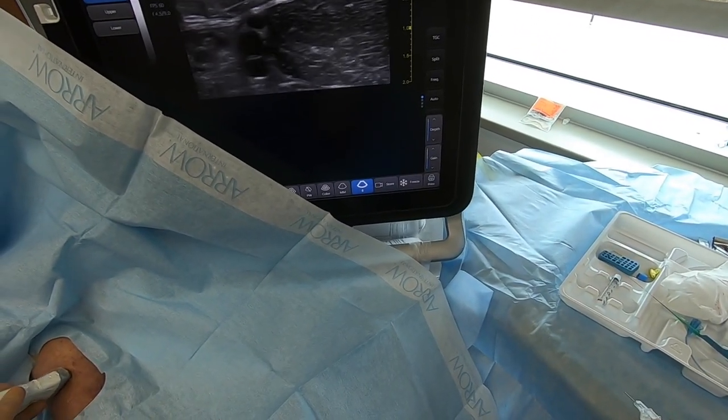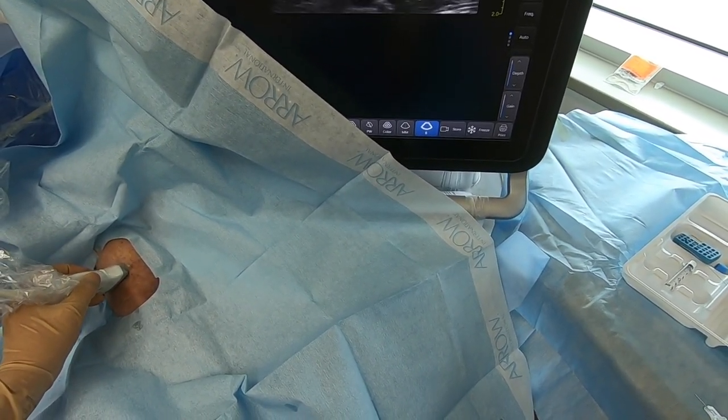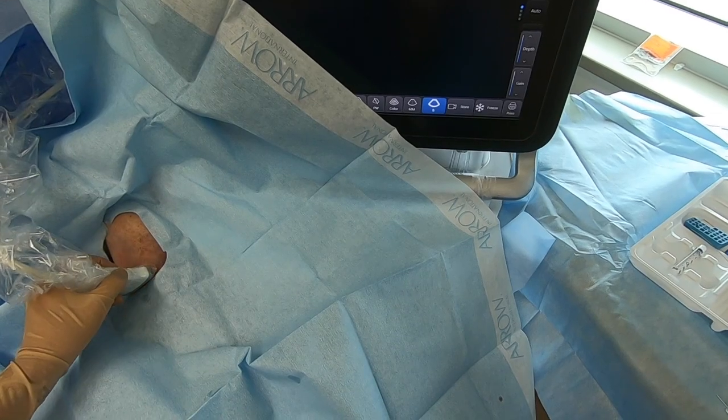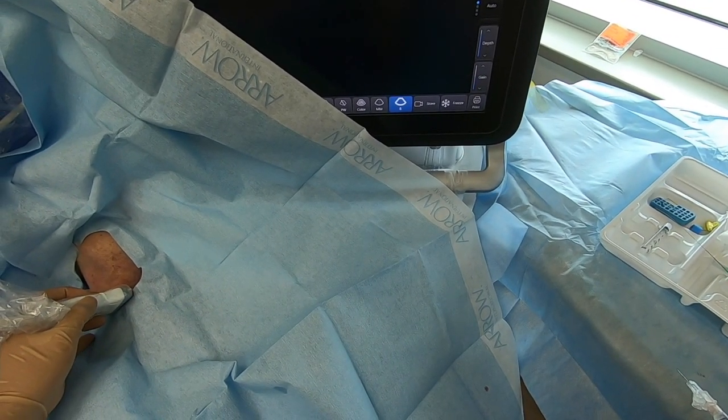These are going to be placed in one of the arm veins. Typically we'll start with a basilic, but the brachial is also viable and that's what we're using today. You can try the cephalic — it usually looks good, but tends to be hard to access.